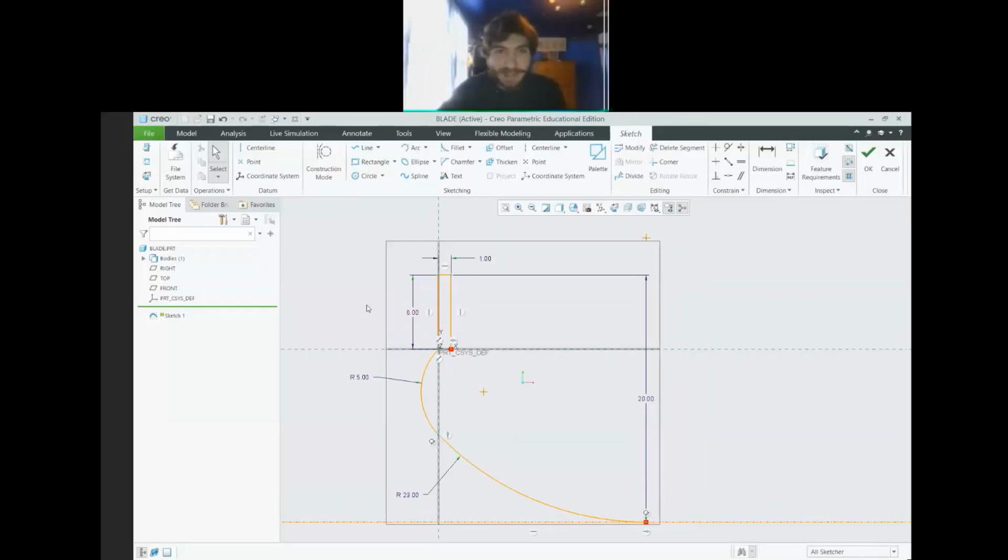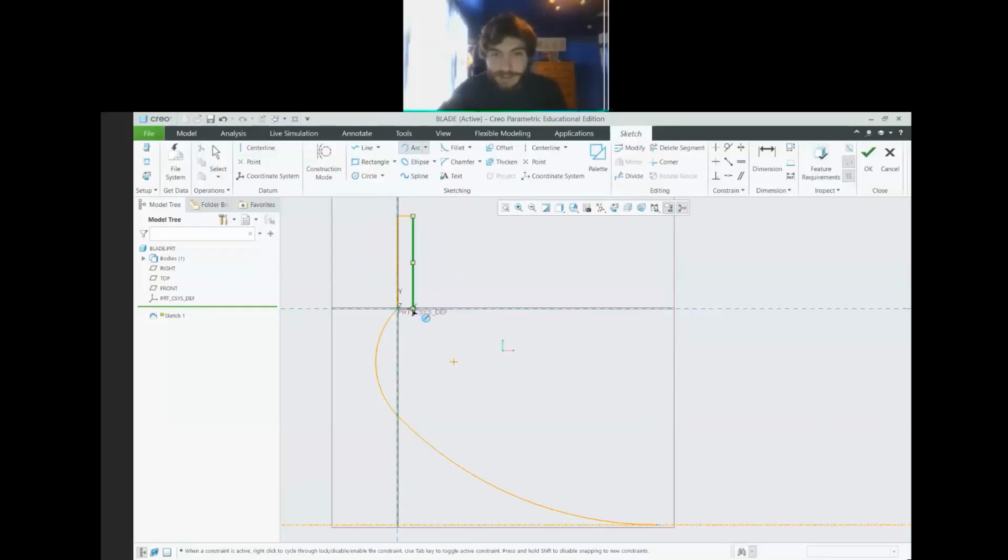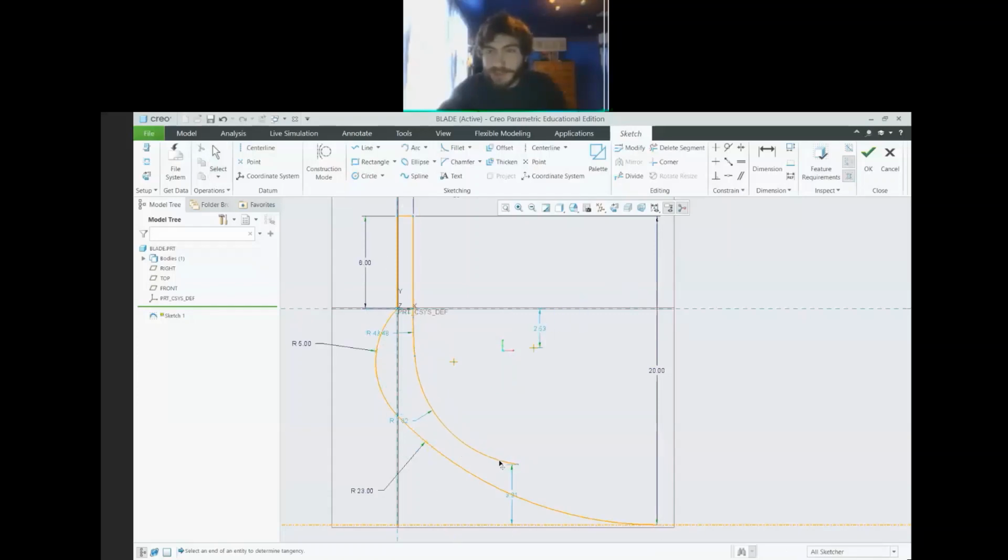All right, so there are a couple ways to do the next part. We'll do maybe what's the easiest. We'll go back to this arc tool, the three points, and create another arc, so we just create our two arcs. That's fine. Then we come up to our constraints again, and these two horizontal lines are our equal constraint. We'll click our first arc and our second, and now they become the same arc.